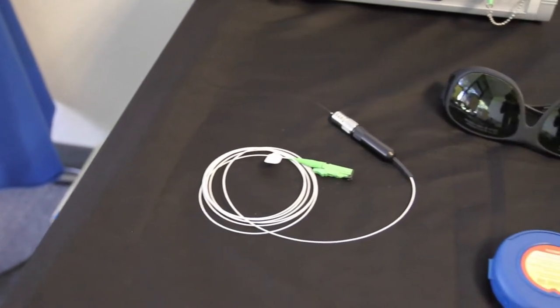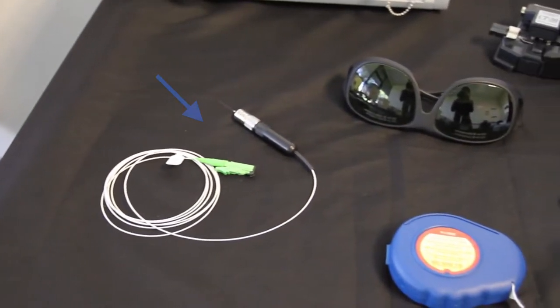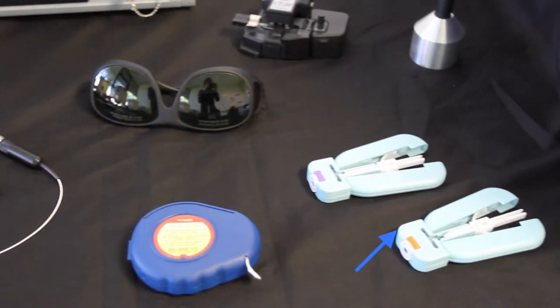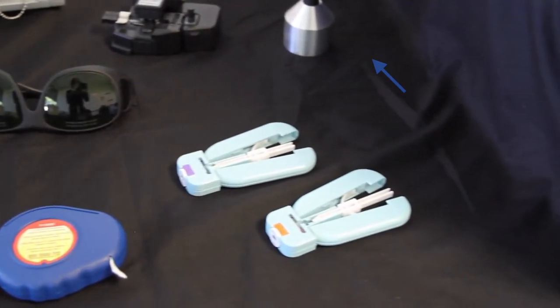The HFO comes with multiple fiber optic probes, laser safety goggles, a fiber probe cleaner, a fiber cleaver, two fiber stripping instruments, and a DC calibration kit.